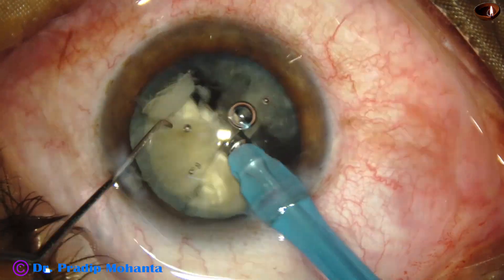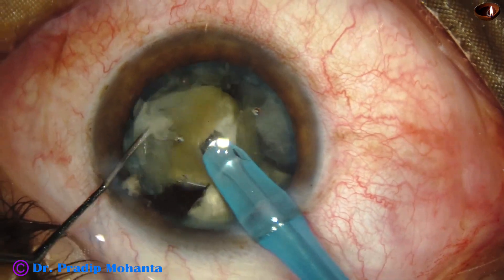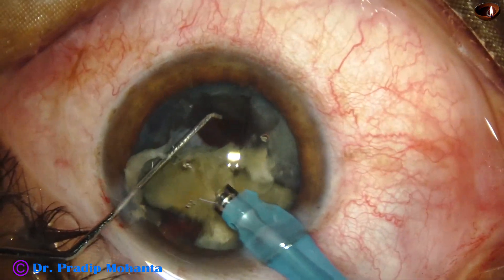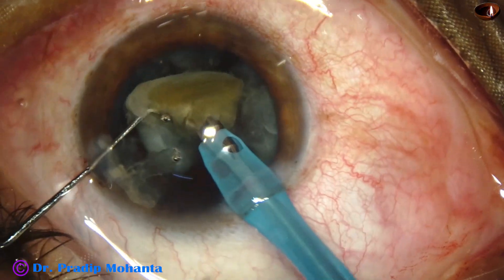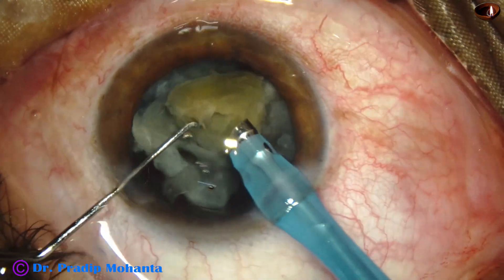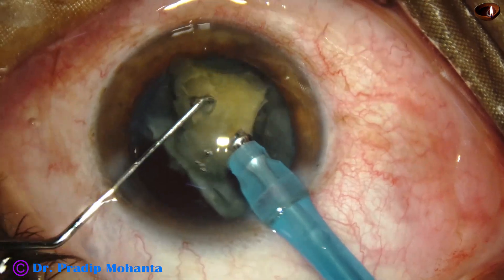And now this is the third fragment. At this time, I am trying to detach the epinucleus shell and using it as a cushion. The epinucleus — getting only the nuclear mass — the epinucleus is protecting the PC.